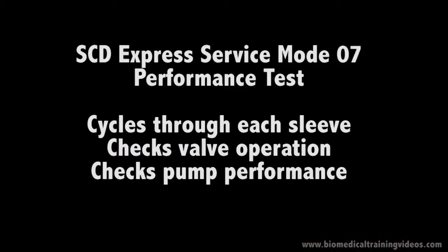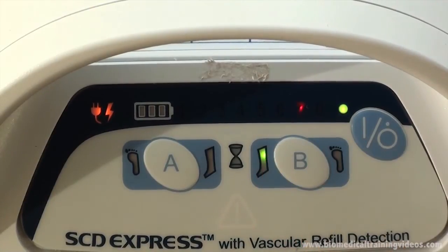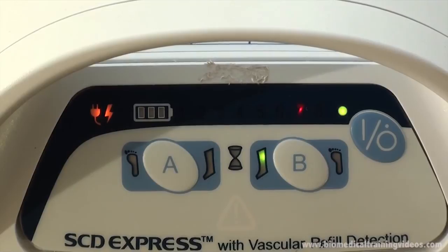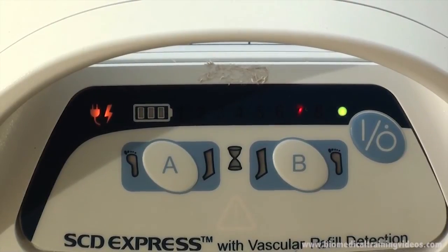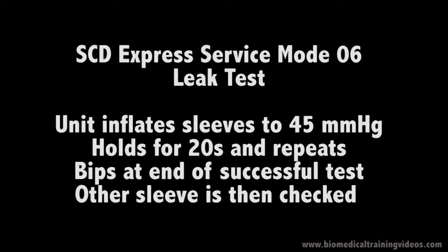Next is test mode 07, the performance test, and test mode 06, the leak test. For the leak test, you would normally apply two sleeves. I have only connected one for this test, but effectively it is the same for both sides.